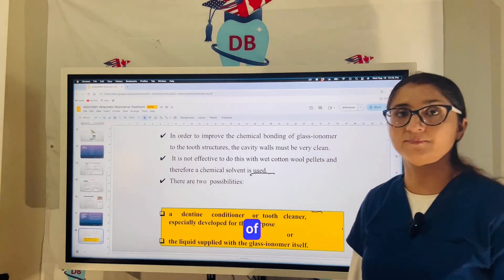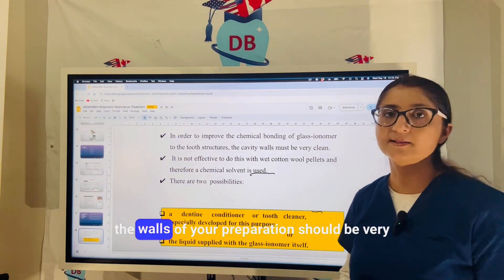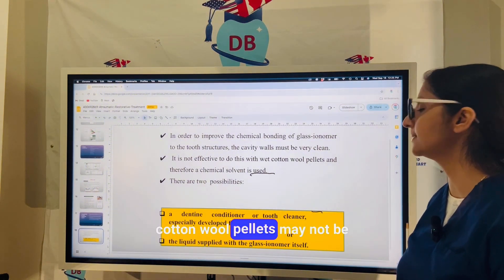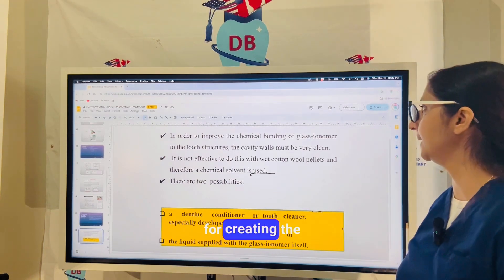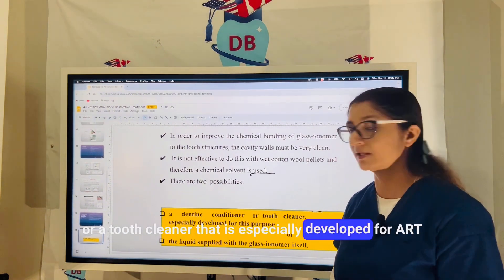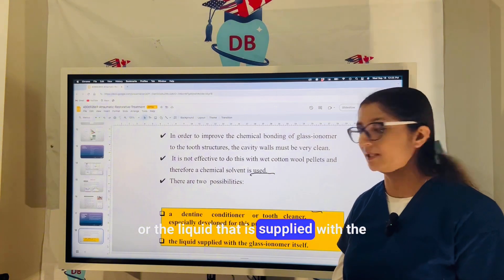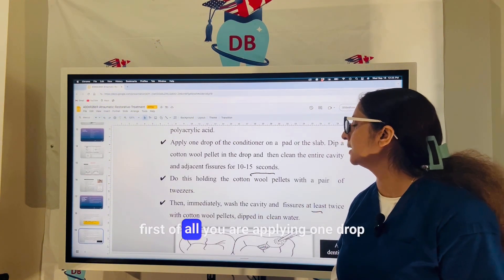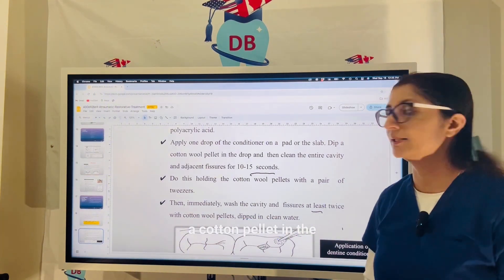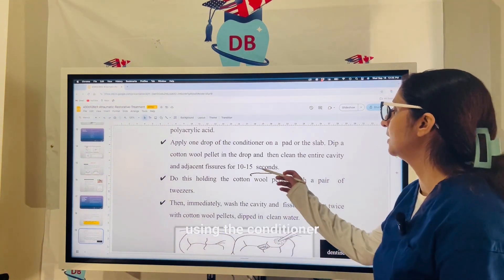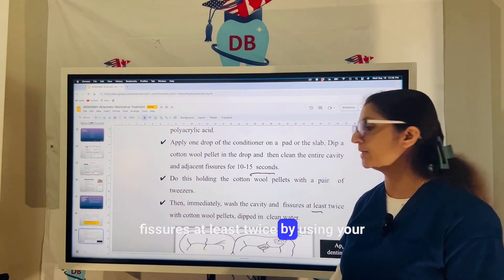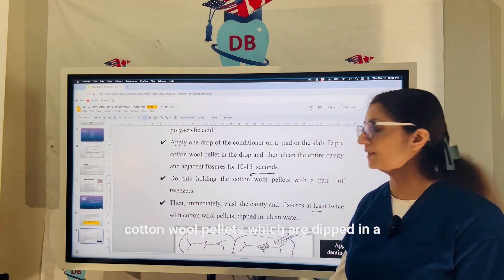To improve the chemical bonding of GIC to the tooth structure, the cavity walls must be very dry and clean. A dentine conditioner or tooth cleaner developed specifically for ART, or the liquid supplied with the GIC itself, can be used. Apply one drop of conditioner on a pad, dip a cotton pellet in the drop, and clean the entire cavity for around 10 to 15 seconds. Immediately after, wash the cavity and fissures at least twice using cotton wool pellets dipped in clean water.